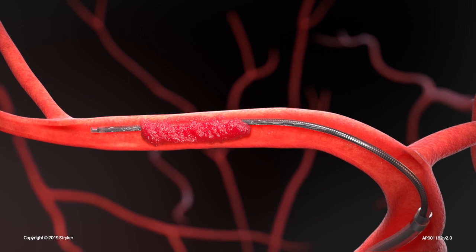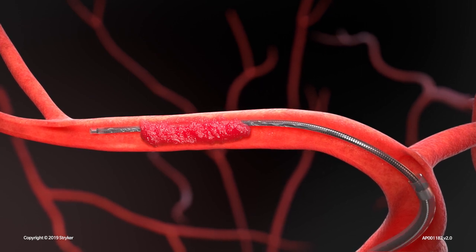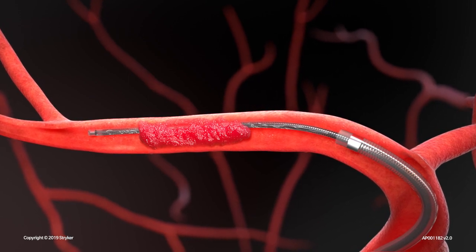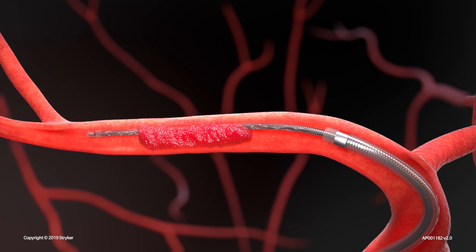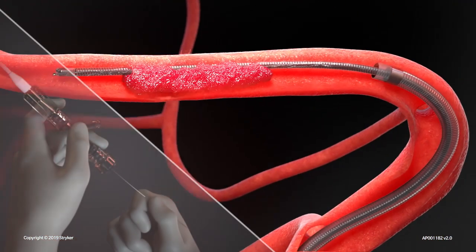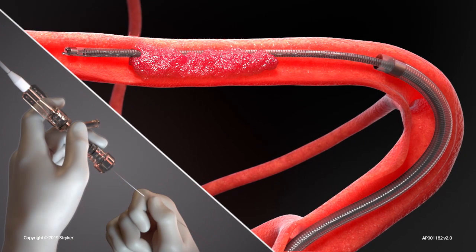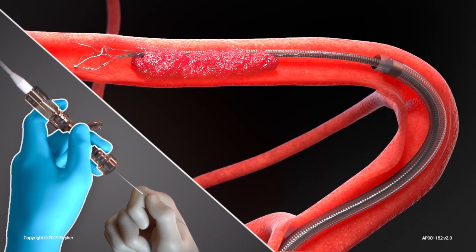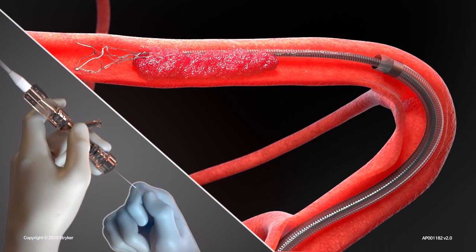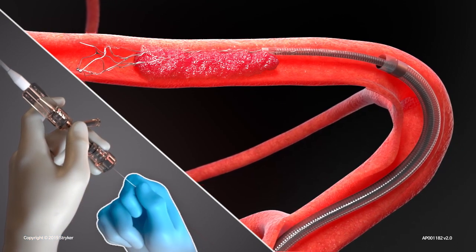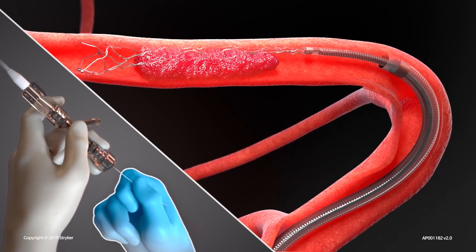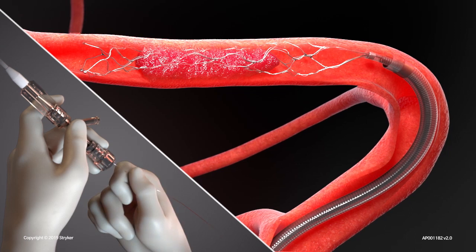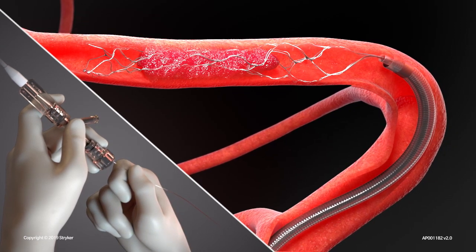A catalyst distal access catheter may be advanced over the microcatheter and positioned just proximal to the clot. Unsheath the distal tip of the retriever. Gentle forward pressure is then applied to the wire while keeping the microcatheter stable until the retriever's clot capture zone is optimally positioned in the clot. This forward pressure enhances stent expansion to improve clot integration.